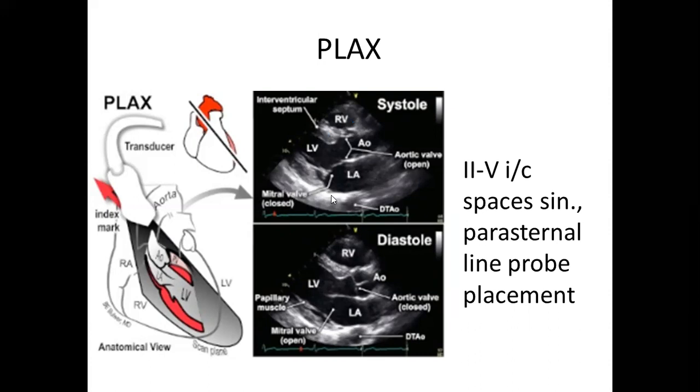So you can see this slight enhancement, a higher acoustic response from this area, because we have fluid inside of the chamber, and it amplifies the USG wave.